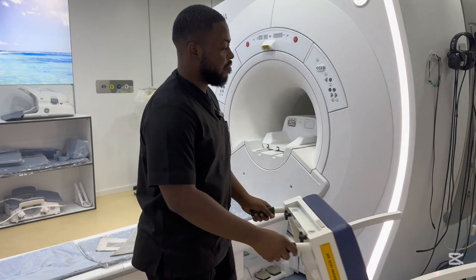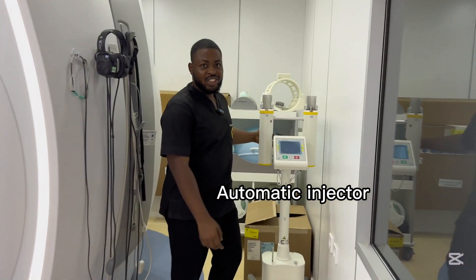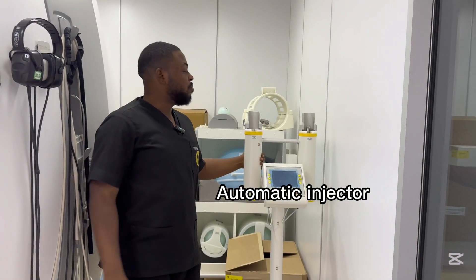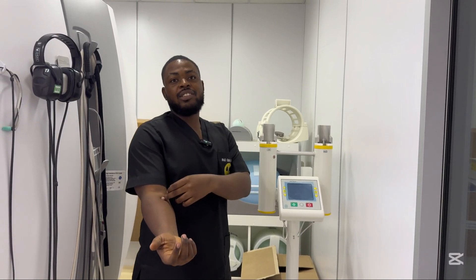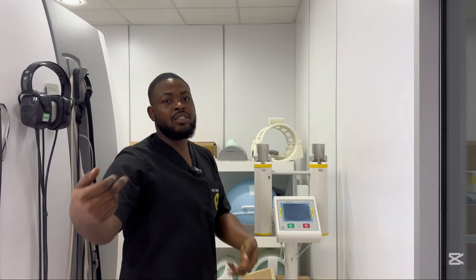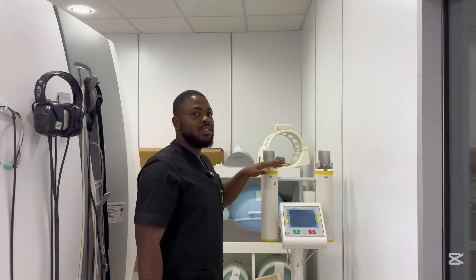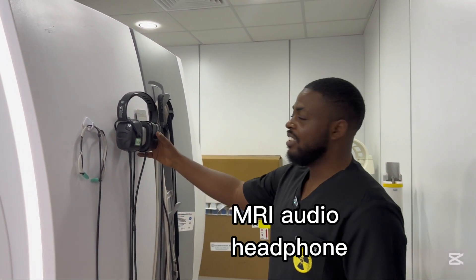Here we have the automatic injector. It can be connected to the patient when they're inside the MRI machine via a cannula line on the person's arm, and then we can introduce contrast. We don't need to come in and inject anything from outside — you just press the button and it starts going into the person's body immediately.